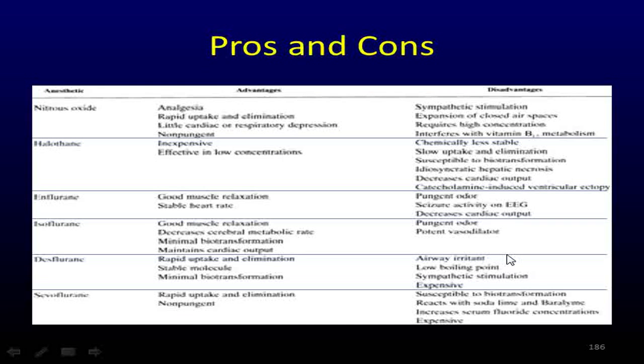What about desflurane? What is its key benefit? Quick on, quick off. It is the least soluble modern anesthetic. But what is one of the problems, especially for you guys going to the field? You've got to have a special vaporizer. You can't take an electric vaporizer with you.